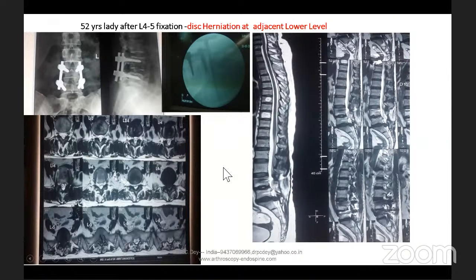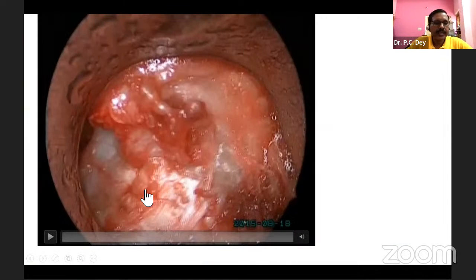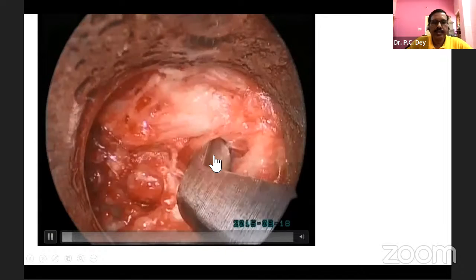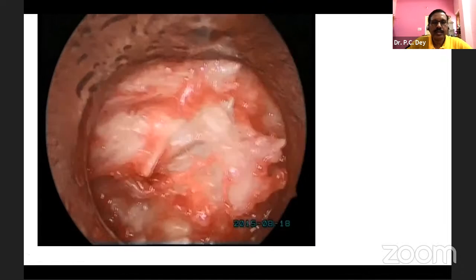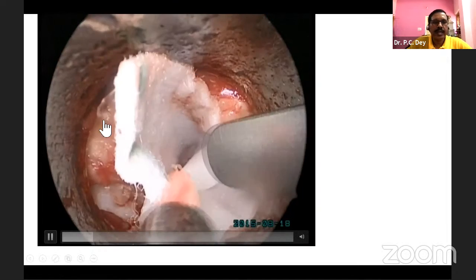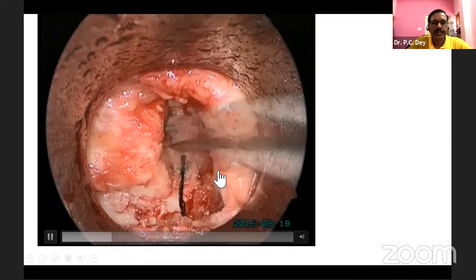Yes. Okay, so this is a 52-year-old lady. After L4-L5 fixation, she landed with another complication called adjacent level disc herniation, that was L5S1, and there is a huge disc. This is the discectomy we did from the right approach. This is L5S1 right approach. In my right hand, this is the cranial end, this is the midline, and this is the caudal end, and this is the facet or the lateral aspect.